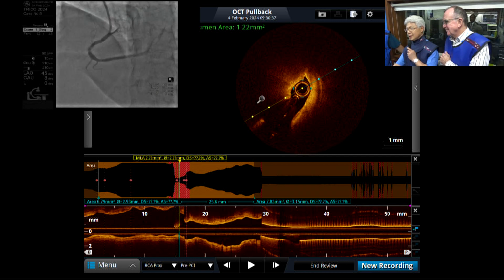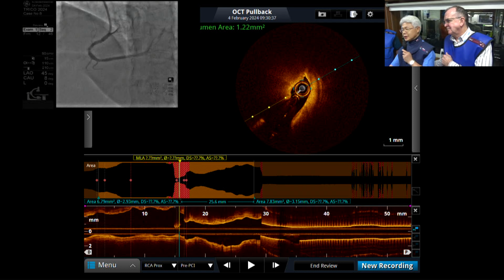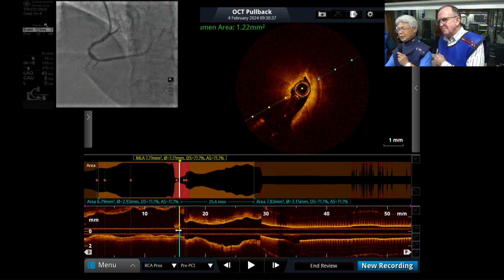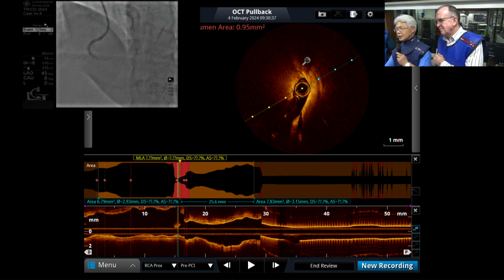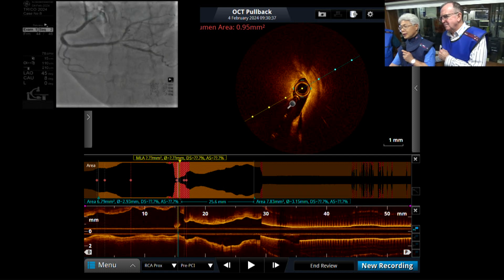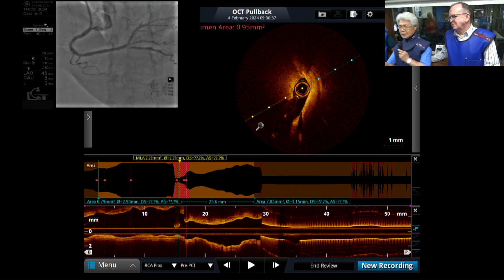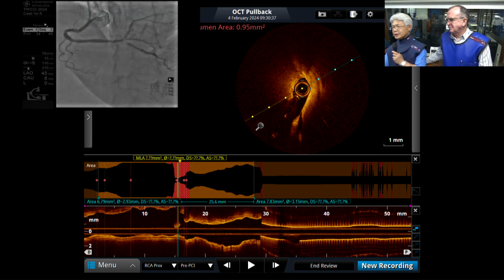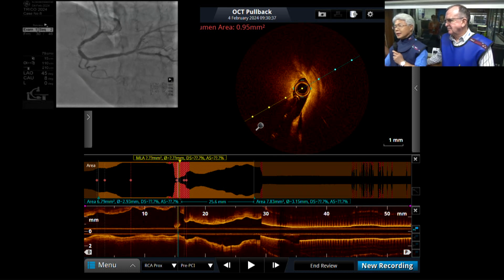I'm just wondering, here is a very thick calcium. Simple balloon dilatation may not work. This is your study, right? Yes. More than 500 micron thickness. The balloon dilatation simply does not work completely. So if you dilate, you can identify some dissection here and here, right? But not here. And the wire position is very good, so some rotablation is the best way to modify the lesion first. And after that, we can decide on IVL or something.